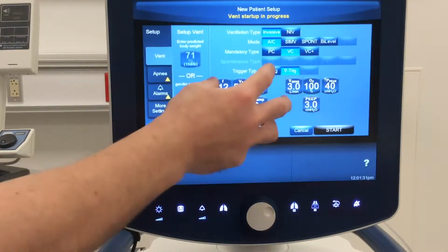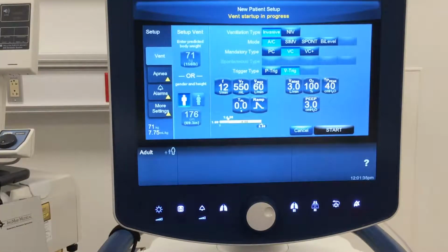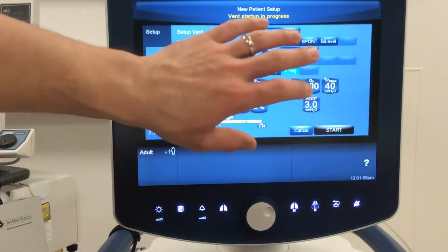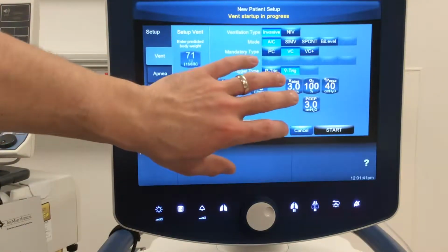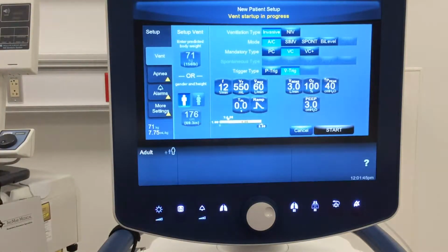So these are kind of what I consider our core controls for how we're going to ventilate this patient. Okay, so this is the core aspects of volume delivery, or the core aspects of inspiration. Okay, over here it's kind of got things segregated. All right, let's talk about what we have.